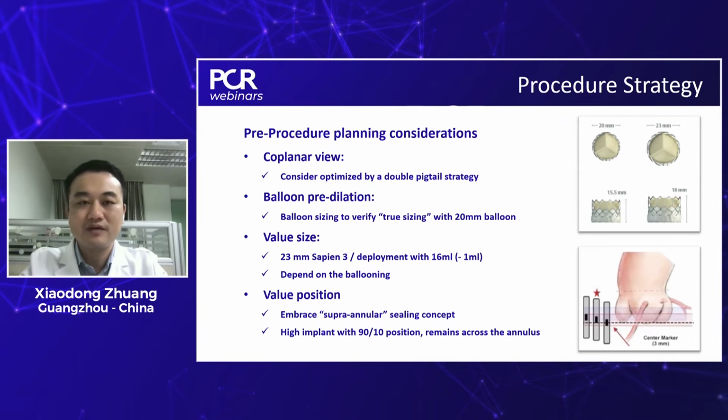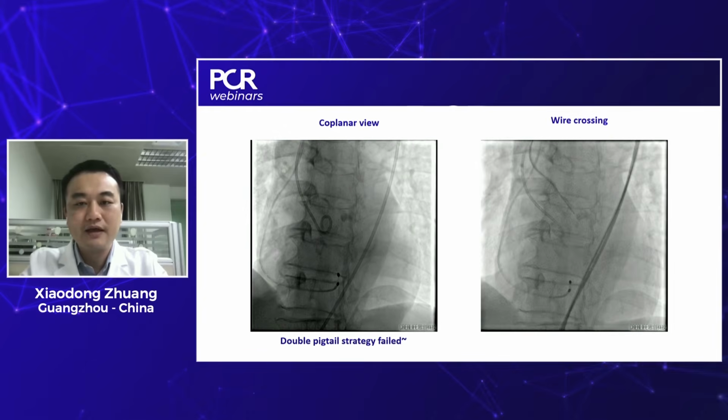I can see Dr. Palmer, your case is also a very high implant SAPIEN 3, so it's a good result for this patient.